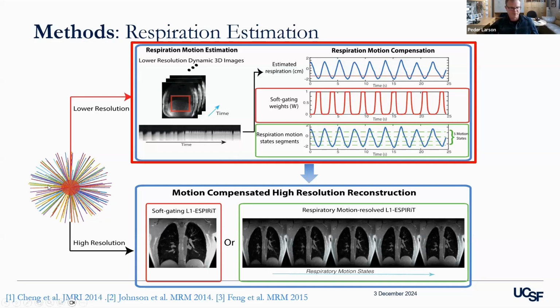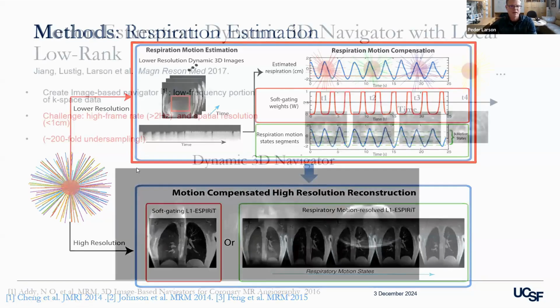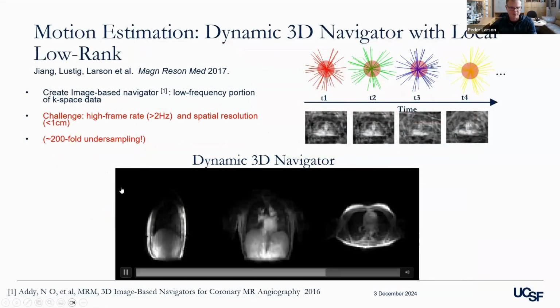And so once you've got the data, doing everything after that had to use a lot of specialized tools, I would say. Just a flavor for one of those is trying to do these high frame rate, highly undersampled reconstructions to watch different breathing patterns and things like that, image navigators.